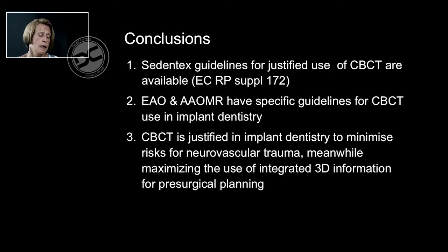From the present lesson, we can conclude that there are guidelines for justified use of CBCT. You can find them on the internet by typing radiation protection 172. Furthermore, the EAO and the AAOMR have specific guidelines related to implant dentistry. In any case, cone beam CT is justified in implant dentistry to minimize the risks for neurovascular trauma, meanwhile maximizing the use of integrated 3D information for pre-surgical planning.